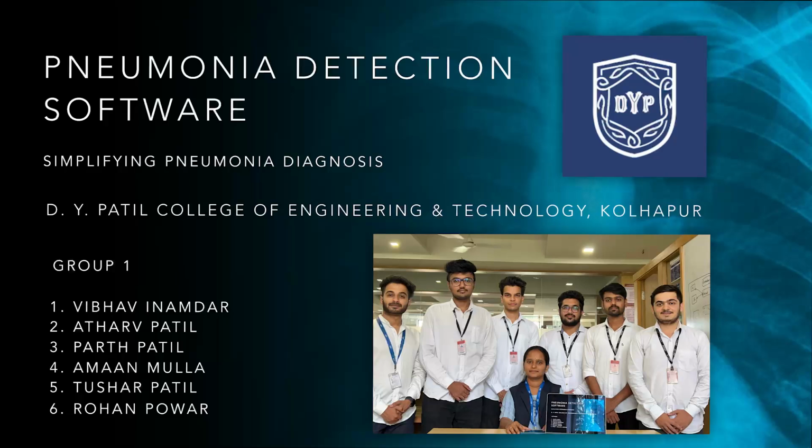The project was developed by Group 1 of Computer Science Department from DYPCET College of Engineering and Technology, Kolhapur. Our team members are myself, Vibhav Inamdar, Atharv Patil, Amaan Mulla, Tushar Patil and Rohan Powar. Our aim is to simplify the diagnosis of pneumonia using advanced technology. We have utilized the CNN ResNet 50 algorithm to develop a software solution that can detect pneumonia from chest X-rays.